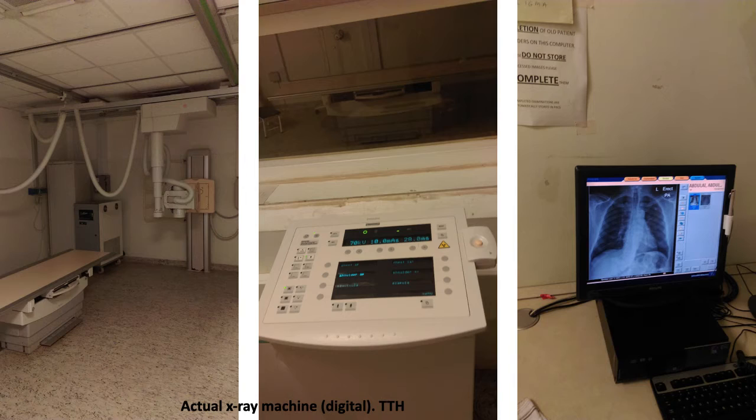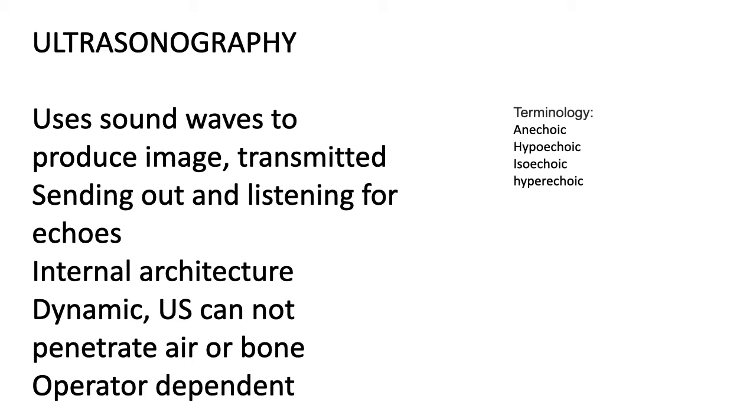So let's go on to talk about another study, ultrasonography. The good thing about ultrasonography is that we don't use ionizing radiation. For that reason, you can see daily a lot of pregnant women doing obstetric scans, because there is no damage so far from the ultrasound to the baby. Ultrasound uses sound waves to produce the image, and the good thing about ultrasound is that we can see the structures in real time.